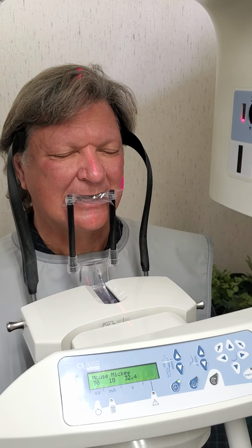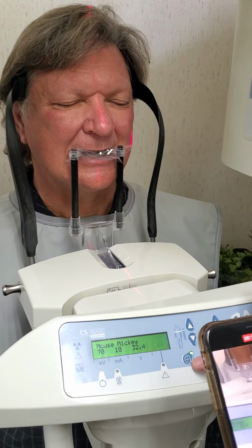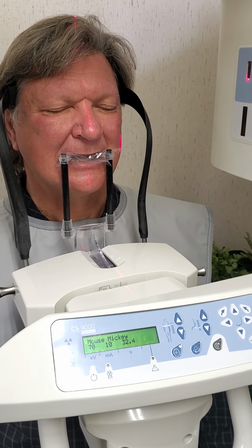And what button is the laser beam? It's the one with the plus, the crosshairs. Okay.